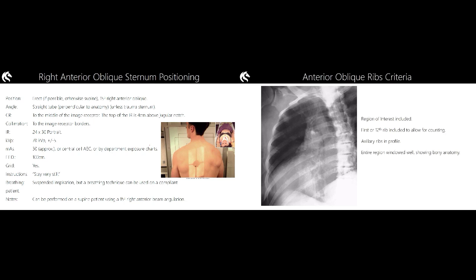Here goes. We have got an X-ray table here. We have got the long axis of the X-ray table. Okay, and we can quite easily, with our tube, angulate one way or the other, up the bed or down the bed. All right. We've got our bucky tray, which we can displace inferiorly or superiorly as we need to. Here goes. Let's say, for example, you needed to do a couple of obliques of the sternum.